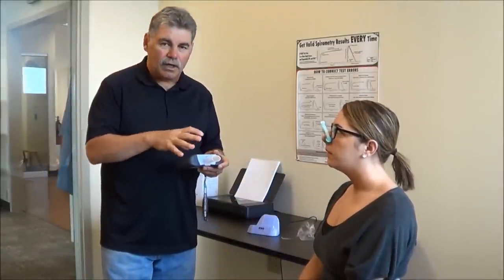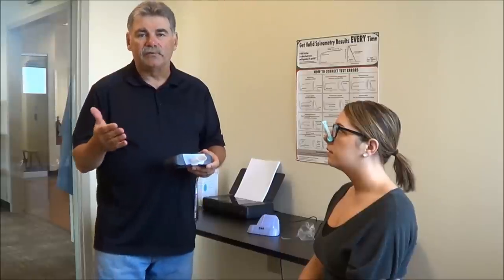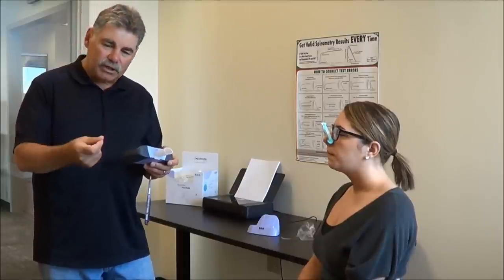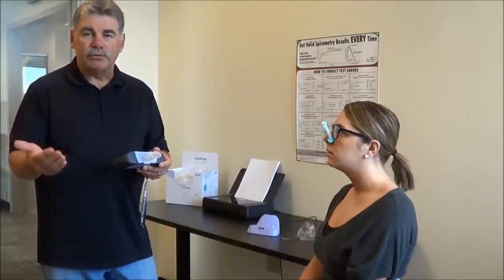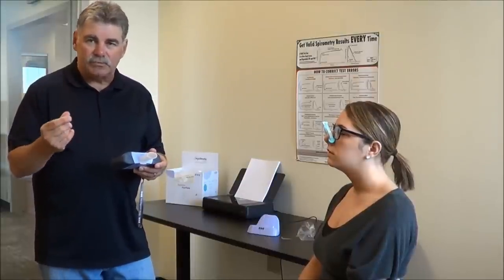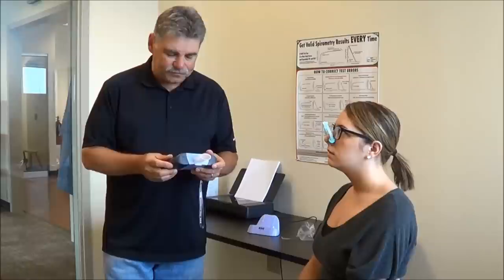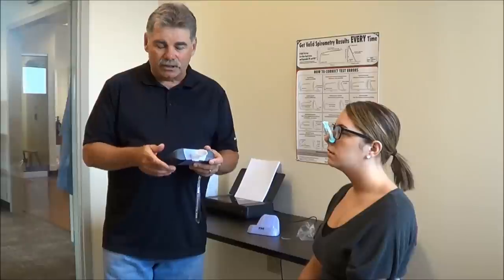Now the other aspect of quality in the software of the device is we have a grading system in here, an A through F grading system like school grades. So what we're grading on is the acceptability of the blow, whether she started nice and fast and continued to go until no more air, and reproducibility. In spirometry, it's important that we get these three acceptable trials, but they also need to be reproducible. The FVC and the FEV1 ideally need to be within 150 milliliters of one another. So we have a grade displayed here that's telling me where I stand with regard to quality.